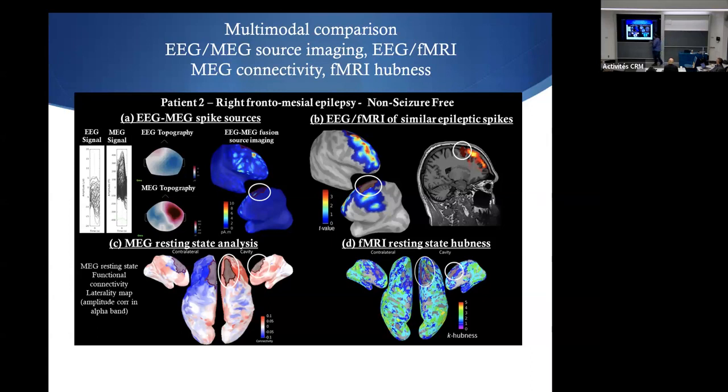But when I look at the probability with the cavity here, there is way more red here and some extended red regions like connections from here. So that was not a good sign according to our previous paper. And when you look at the hub map, it's not very clear. And analyzing hub maps is difficult because these are discrete values between 1 to 5. And what you find out, it's a tiny point, but you see a point here, which is a hubness of 4. And that's really a lot.